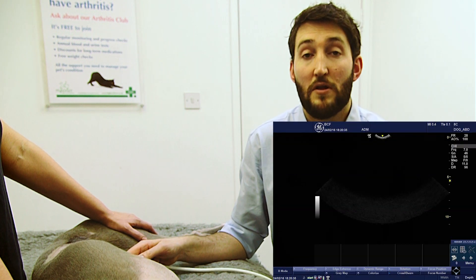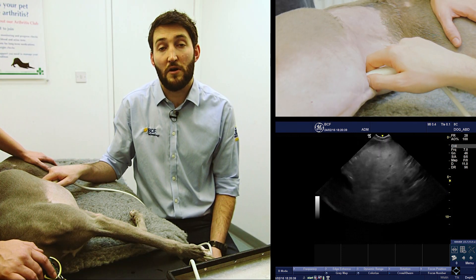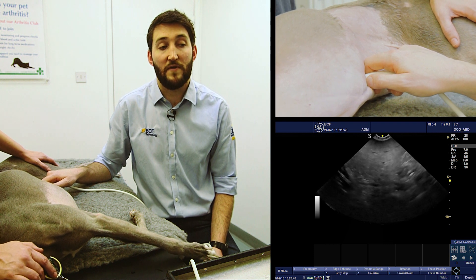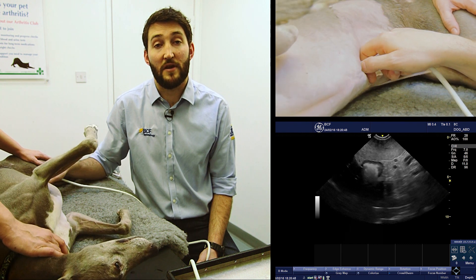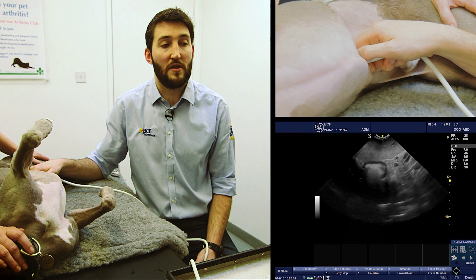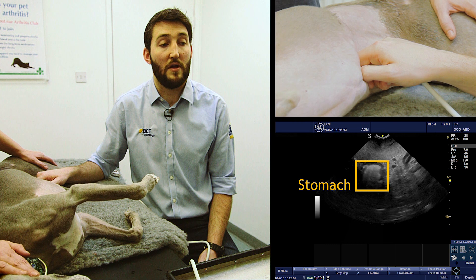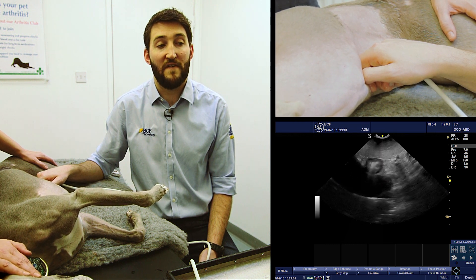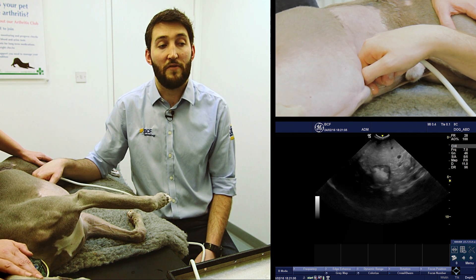To do that we're going to start by placing our probe in a longitudinal — specifically sagittal — plane up against the costal arch, and we're going to acquire a view of the stomach. If you're not happy getting a view of the stomach, please have a look at our other video from the previous series on how to get an image of the stomach. Once we have an image of the stomach, we're going to get it into the center of the screen.